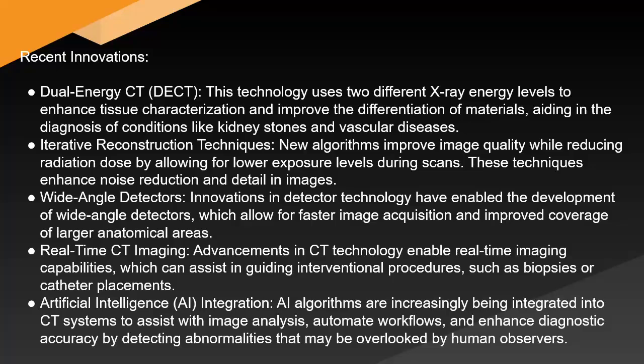Wide-angle detectors: innovations in detector technology have enabled the development of wide-angle detectors, which allow for faster image acquisition and improved coverage of larger anatomical areas. Real-time CT imaging: advancements in CT technology enable real-time imaging capabilities, which can assist in guiding interventional procedures such as biopsies or catheter placements. Artificial intelligence (AI) integration.